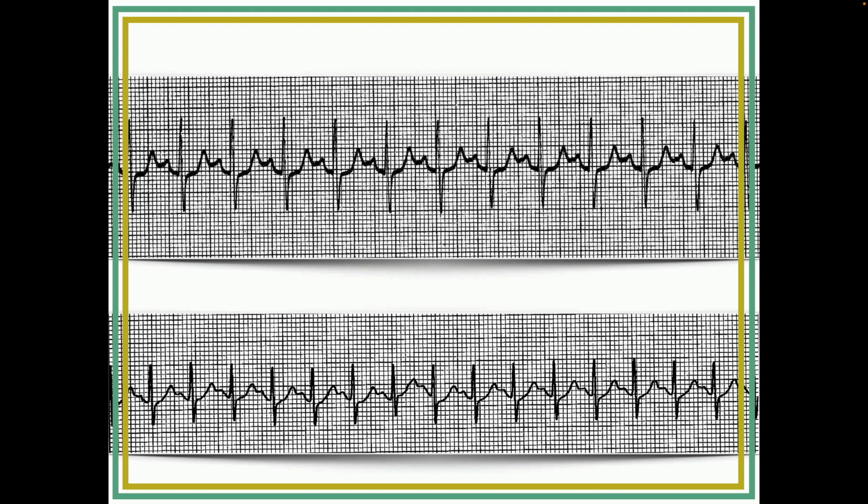Ventricular repolarization. Good. So if you think about it, if things start in a sinus rhythm, for example, and start getting really fast, the ventricles can be repolarizing, and if things are going fast enough, the atria will already be depolarizing. And there's nothing wrong with this. With a fast sinus tachycardia, that's just what happens. But it can make the ECG strip a little more difficult to read.